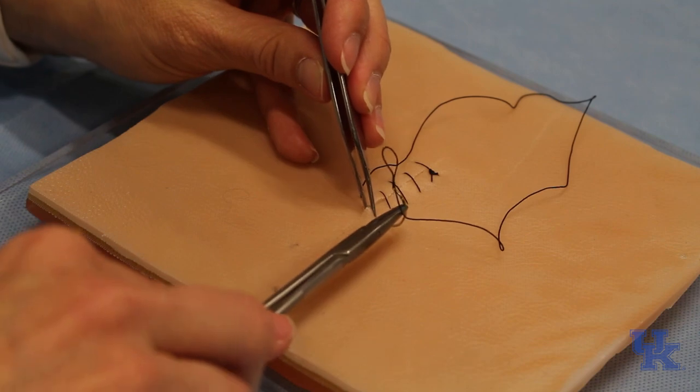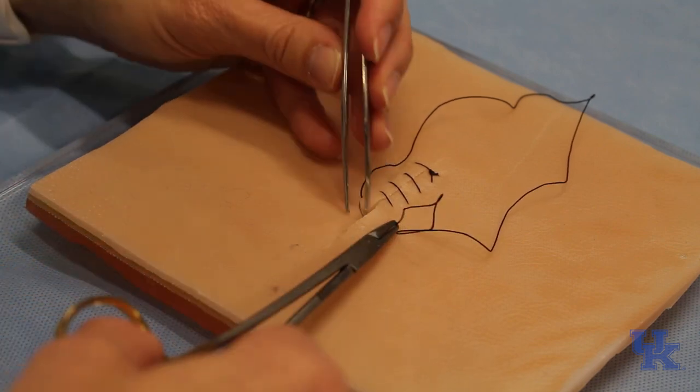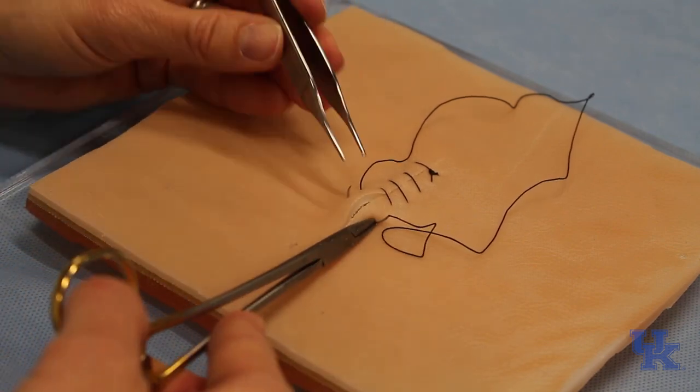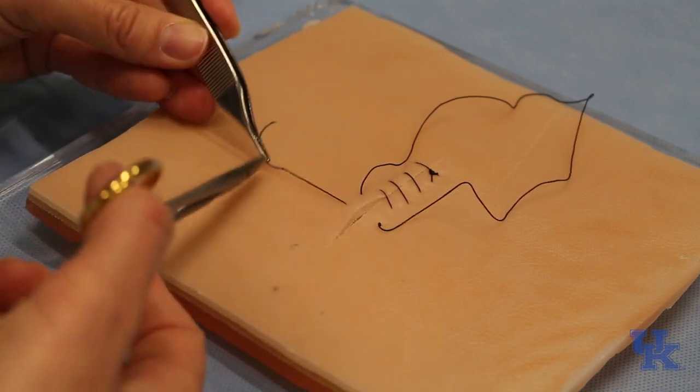Anyway, when you're done, you'll throw your last stitch. I'm going to pretend that we're at the end of the incision here. Rotate that through.